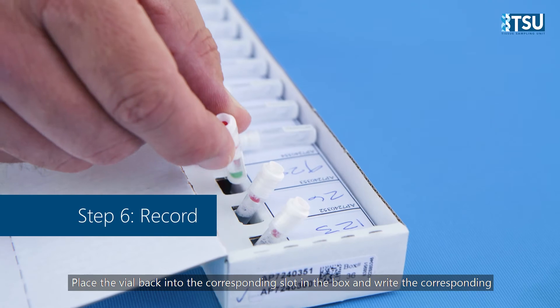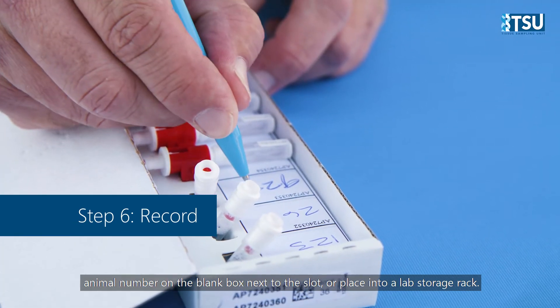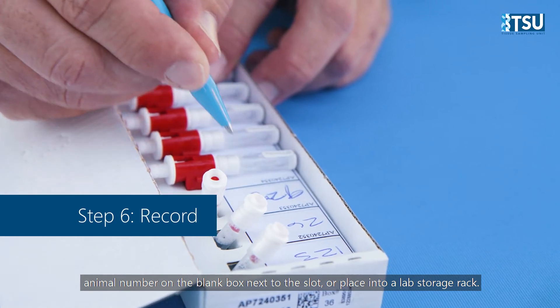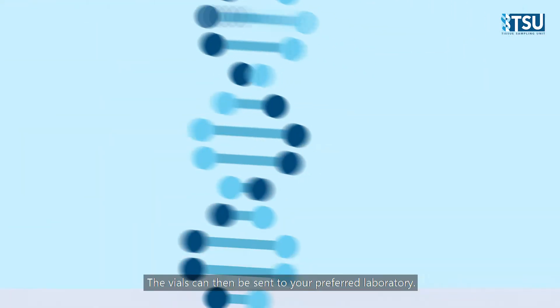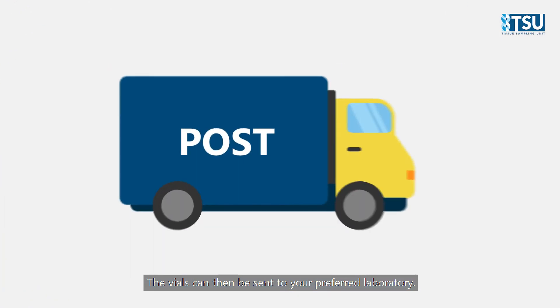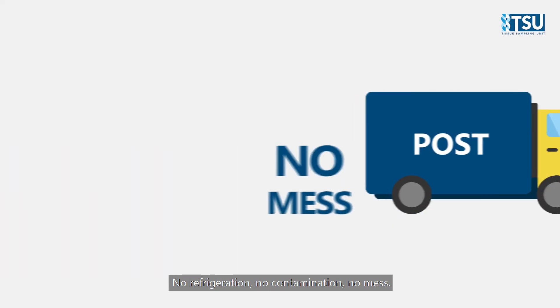Place the vial back into the corresponding slot in the box and write the corresponding animal number on the blank box next to the slot, or place into a lab storage rack. The vials can then be sent to your preferred laboratory. No refrigeration, no contamination, no mess.